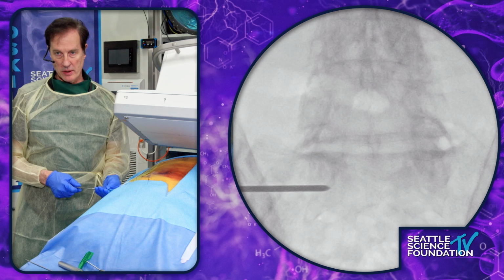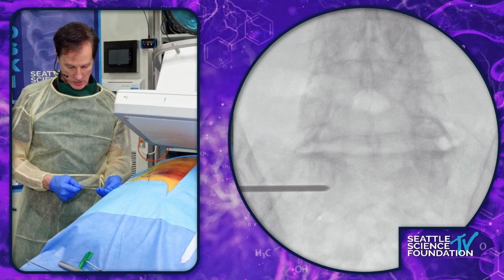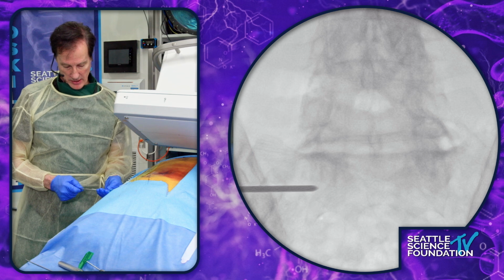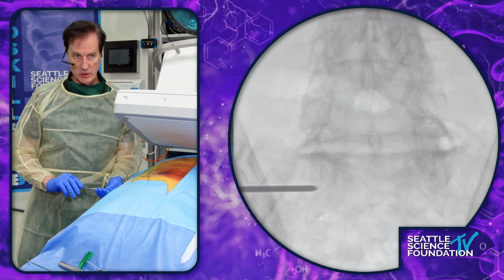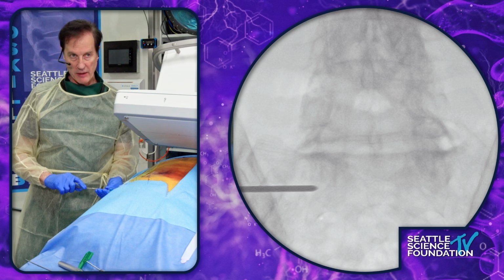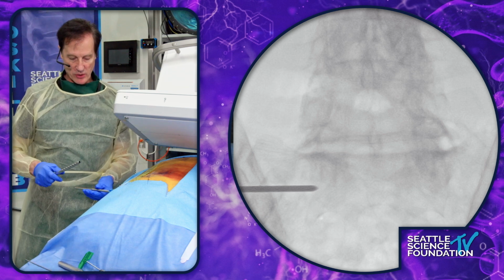Picture, and I'm going to back up the Steinmann pin a bit. Picture, there we go. That's about a 55 right there. I'm looking on the proximal portion of this. This has numbers, and the end of the Steinmann pin registers the number of the size of the implant I need to place. So that's dilator 1.